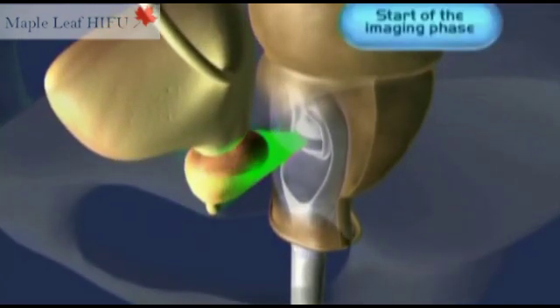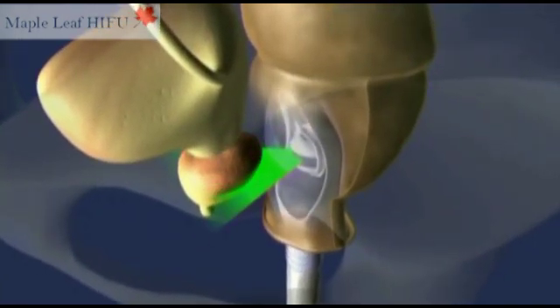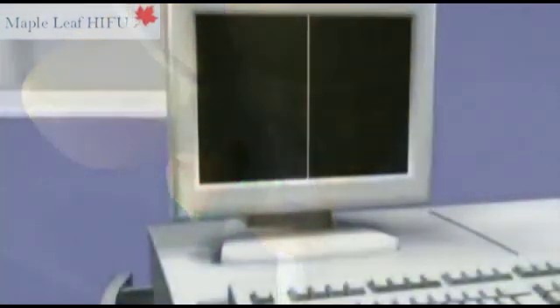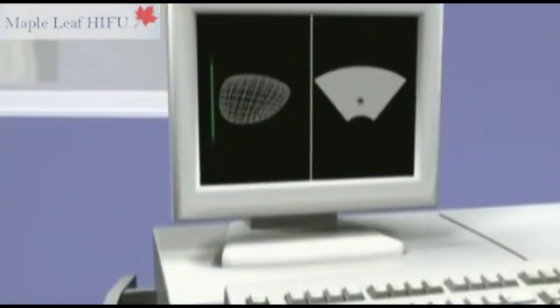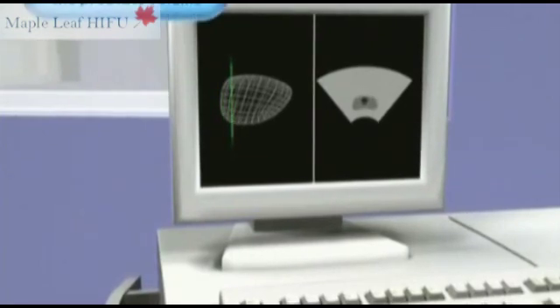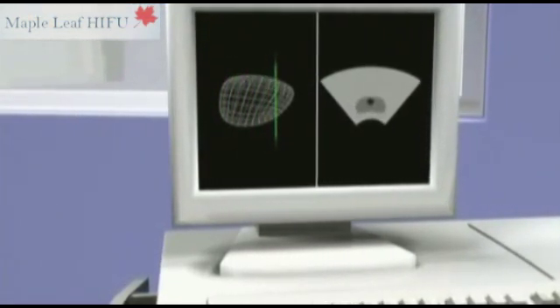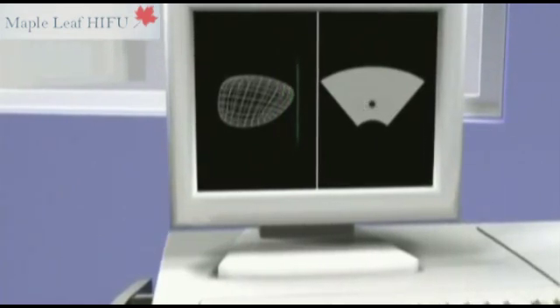The first phase of the treatment involves an ultrasound scan of the prostate. The computerized system will then recreate the prostate in three dimensions to enable the surgeon to plan the treatment on the screen and to program the robot to define the area to be treated.